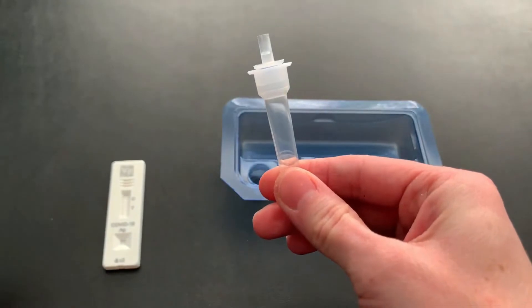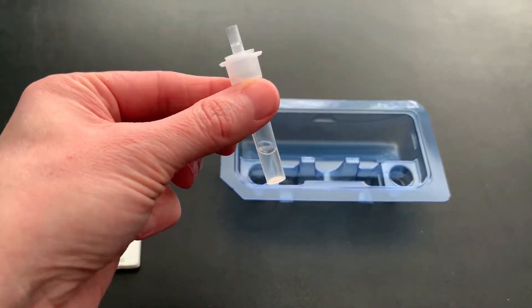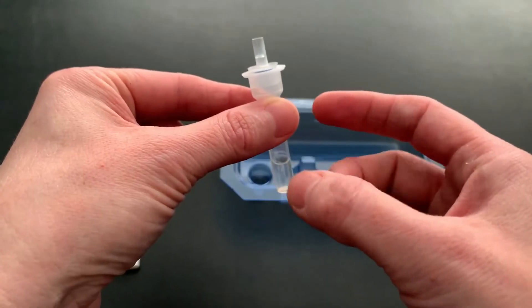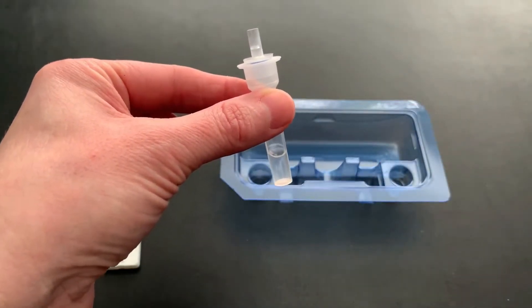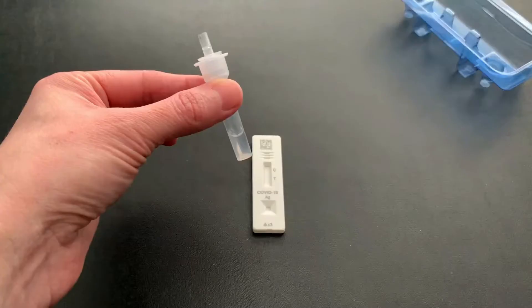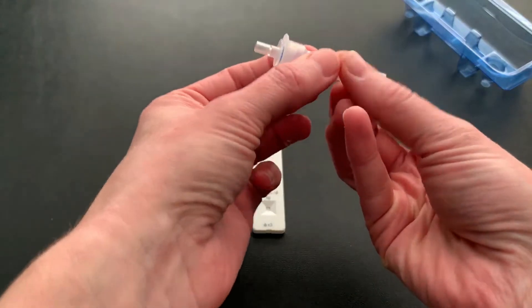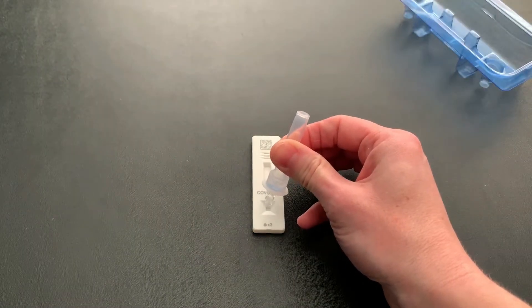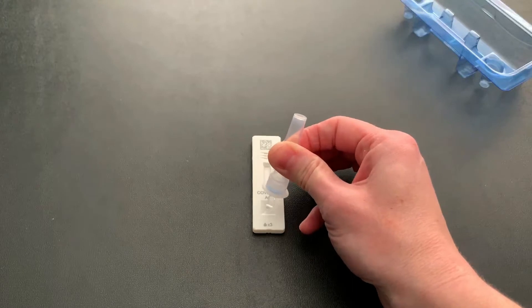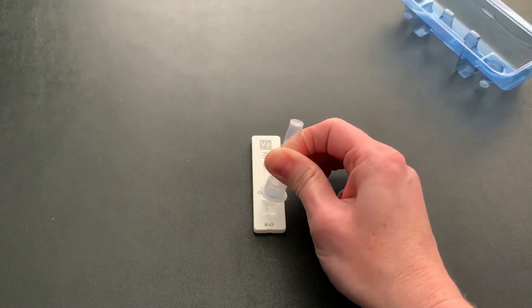In order to thoroughly mix it, go ahead and take your finger and gently flick it at the bottom of the vial. Once it's thoroughly mixed, grab your test strip. Turn over the vial and make sure you get three drops of your sample to fall into that sample well. Remember, you need three drops to make sure the test is effective.